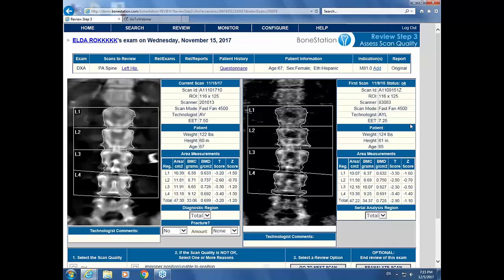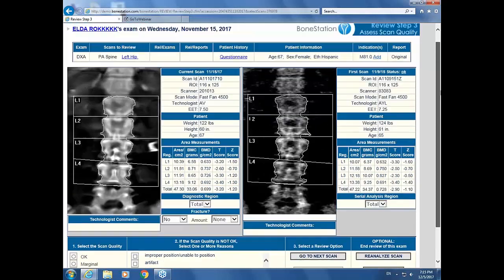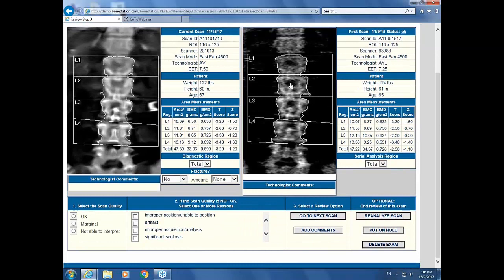We now see the current bone density of the spine on the left and the prior on the right. The same four vertebrae are chosen — L1, 2, 3, 4 — and there doesn't appear to be any particularly dense overlying spot. There is what looks like a metallic clip density that was probably placed in the interval, but since it doesn't overlie the spine, we can ignore it. Running the T-scores confirms no T-score is way out of line with the others. This bone density and the comparison to the prior are technically quite adequate.